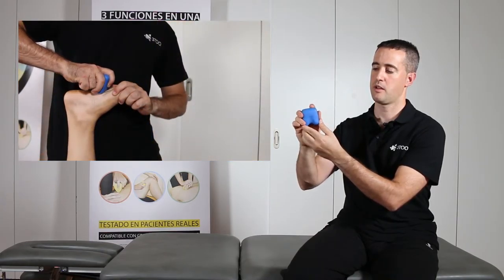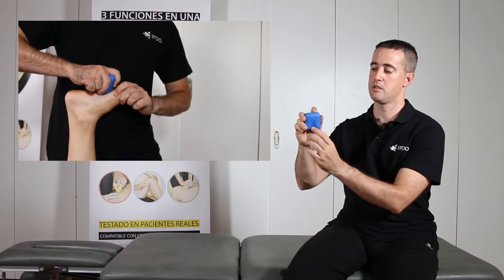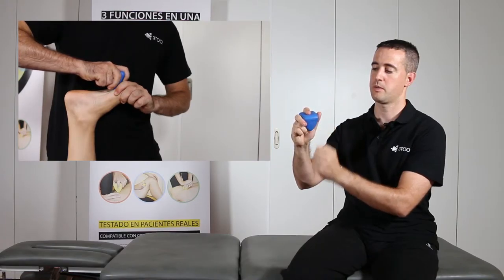Alternatively, if we continue to rotate the tool, one can carry out massage with this rounded zone using this grip or with this grip, which is much more comfortable and ergonomic.